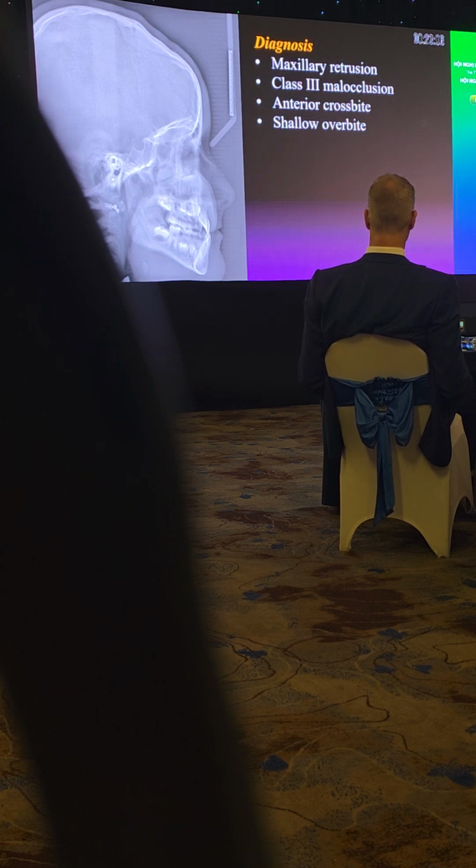So, how are you going to treat this? Patient said, I don't want expansion of the bite. So, how are you going to treat this patient? Any suggestion? Are you going to use brackets or no brackets? No brackets. So, you're going to use clear aligners?